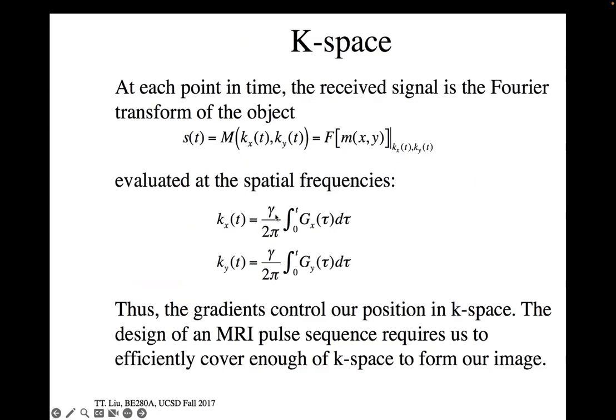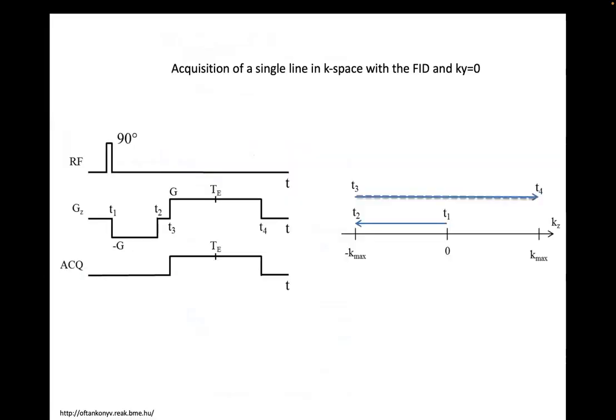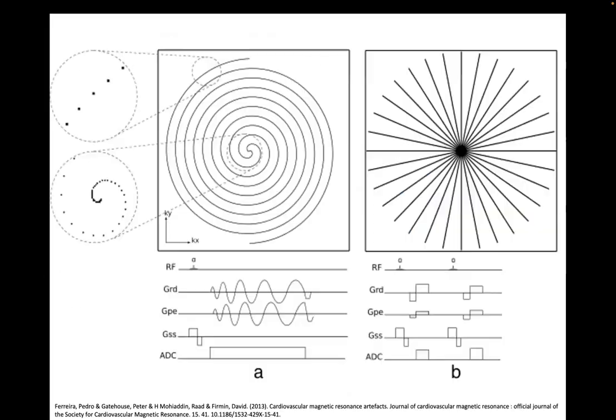So it's called basically a k-space trajectory. When you pulse a gradient in terms of the x gradient, when I turn it on with some amplitude and integrate it from 0 to t, I wind up at a kx value at t, right? And similarly for y. And so the gradients can control our position in k-space, right, for sampling of the object and the position of Fourier space. So I'm not going to do that one though.